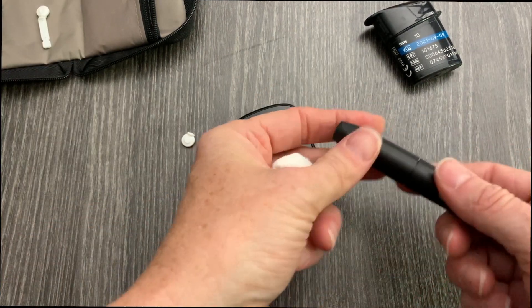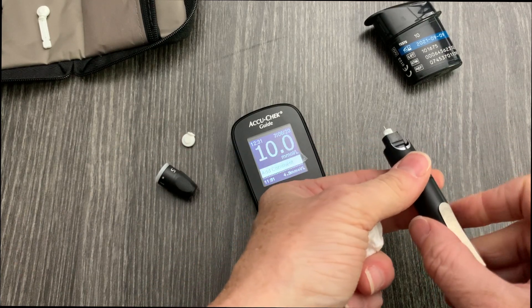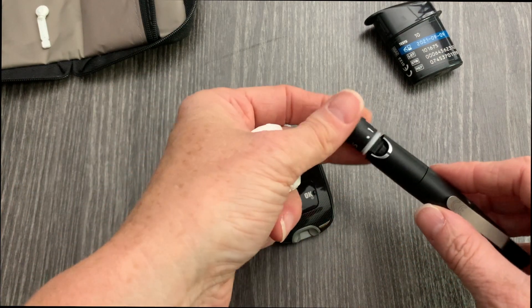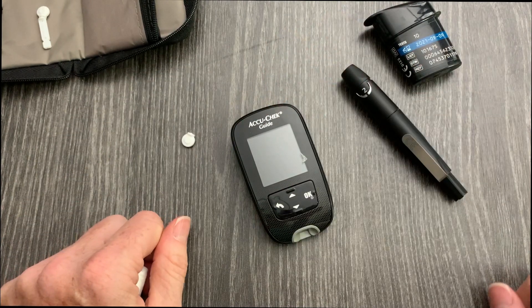After the test, remove the cap, transition the ejector cap forward to eject the lancet, then recap it. Clean all of this up and you're done.